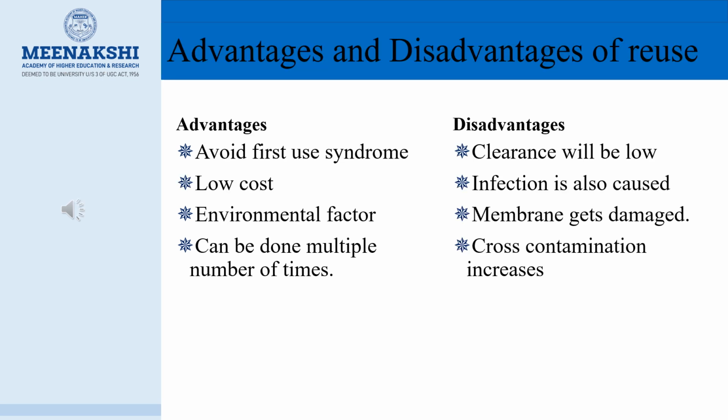Advantages and disadvantages of reuse. Advantages: can avoid first use syndrome, low cost, environmental factor, can be done multiple number of times. Disadvantages: clearance will be low, infection can also be caused, membrane gets damaged and cross contamination occurs.